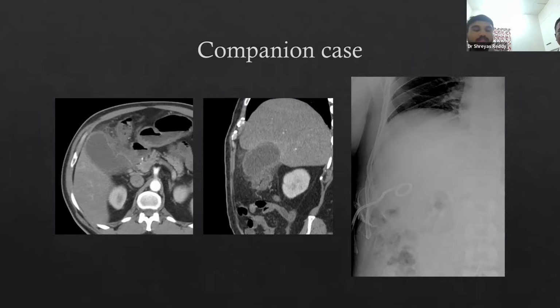So what special catheter do you use for performing the percutaneous cholecystostomy? I just told you, a pigtail catheter. A locking pigtail. Always use a locking pigtail for performing a percutaneous cholecystostomy, because these patients are ICU bedbound. They might be disoriented. They might pull out the catheter also.